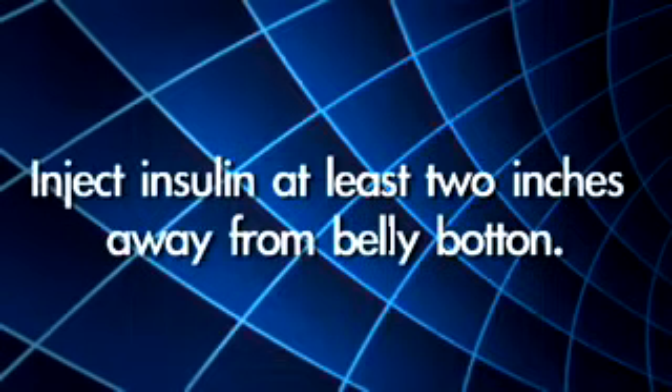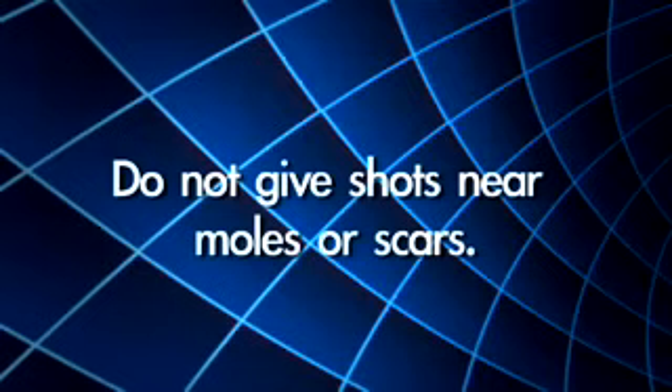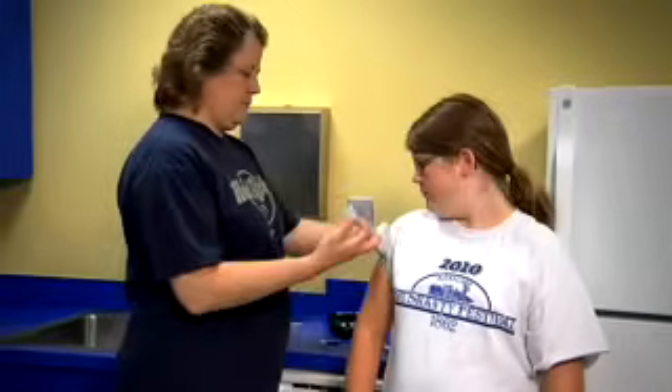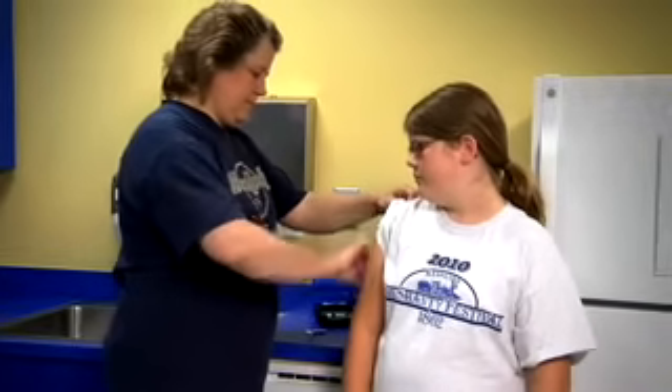Inject insulin at least two inches away from the belly button. Do not give shots near moles or scars. Choose two different places for each shot when taking two shots at one time. Once you have chosen an injection site, clean your skin with an alcohol swab and let it dry before giving the shot.